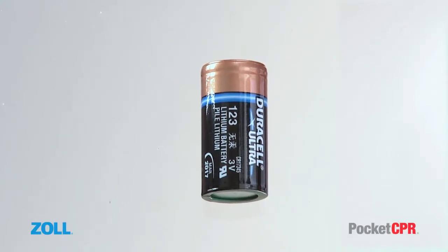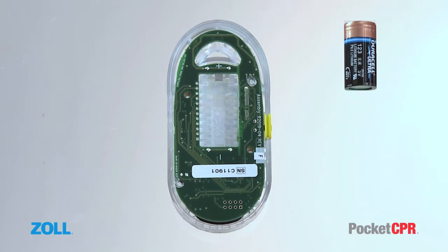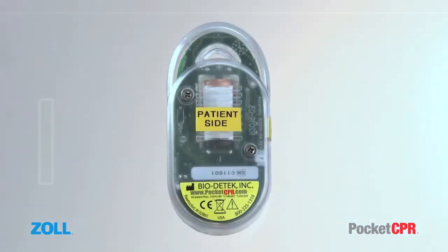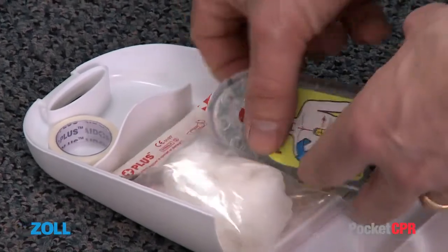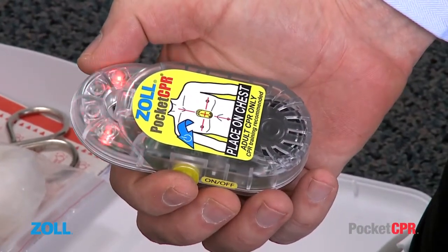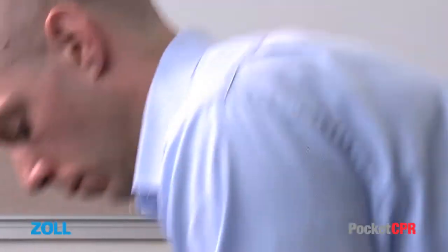The battery shipped with your PocketCPR has a shelf life of 5 years. Our recommendation is to change the battery after 5 years of non-use or 10 hours of continuous use, or at the prompt, "Change battery." If this message is heard during power-up, you may use the device for the current rescue, but you must immediately replace the battery after the rescue or if the metronome light stops flashing. Do not delay CPR to change a battery in the midst of a rescue.